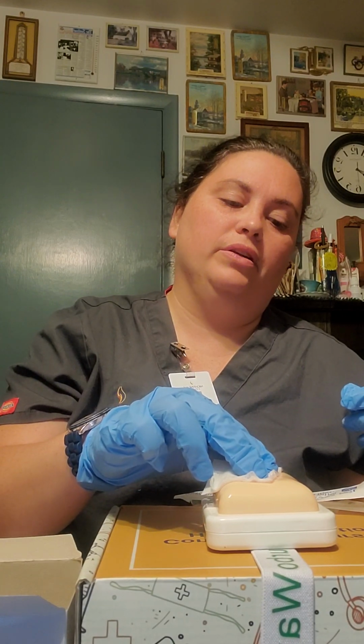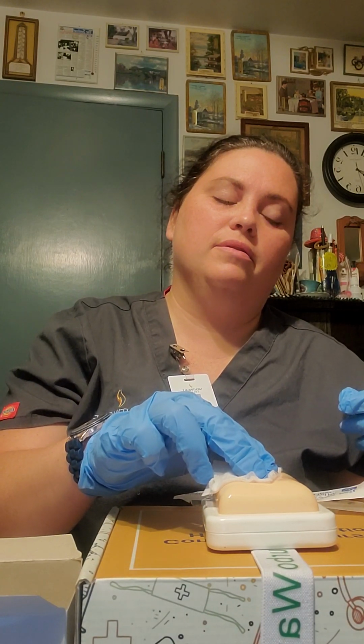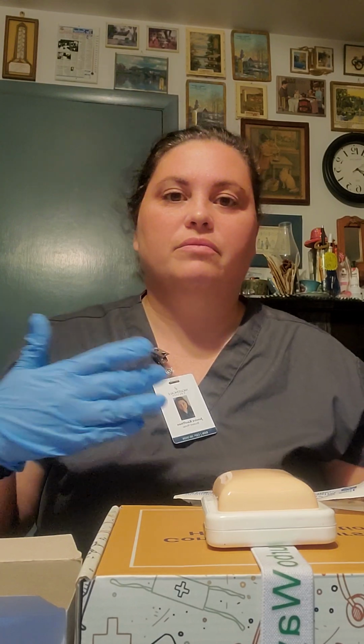Alright, I would hold this here for a couple seconds. I would then check for bleeding. My patient isn't bleeding, so I don't need a band-aid. If my patient was bleeding, I would then put the band-aid on. That way, you know, they're not just bleeding to open air.